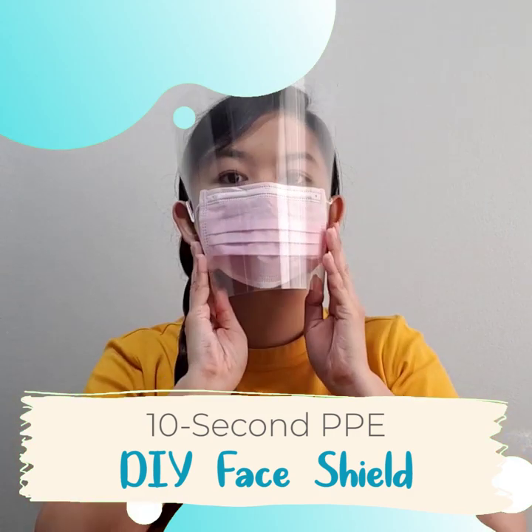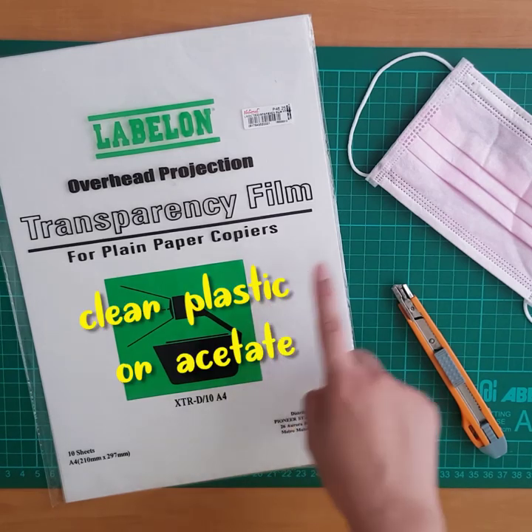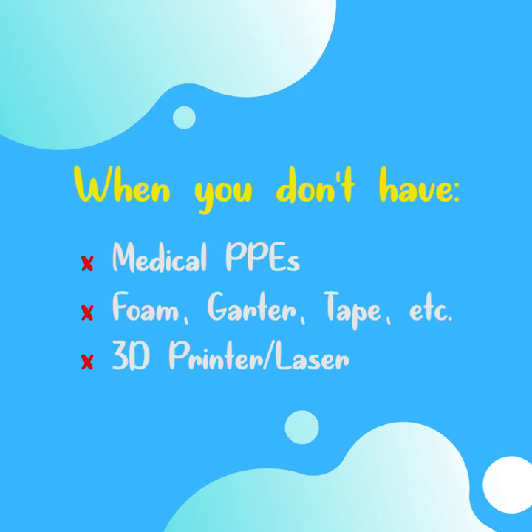Here's the fastest and easiest way to make a face shield. All you need is clear plastic or acetate, a surgical mask, and a cutter. This method can be used when you have no access to medical grade PPEs, foam, garters, or other supplies.